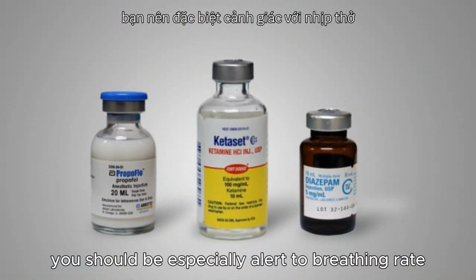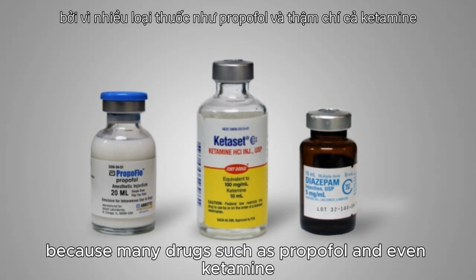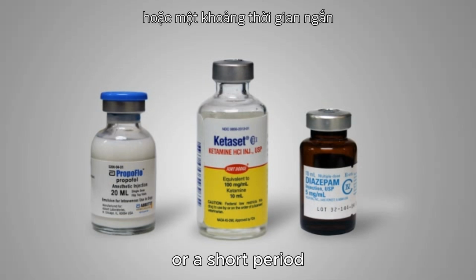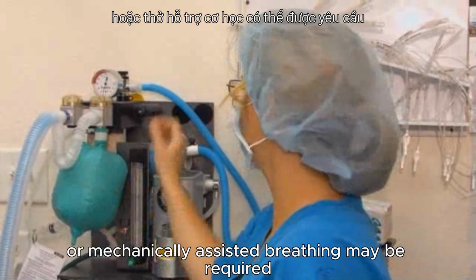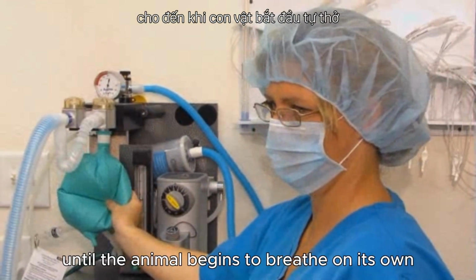You should be especially alert to breathing rate when a patient is first anesthetized because many drugs, such as propofol and even ketamine diazepam, cause a period of apnea, or a short period where the patient does not take a breath. Manual or mechanically assisted breathing may be required for several minutes until the animal begins to breathe on its own.